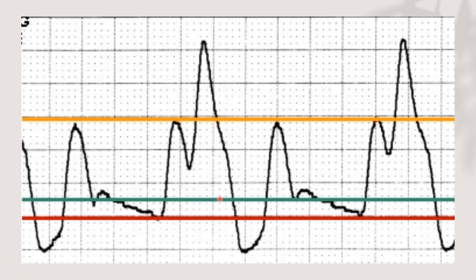Let's practice intra-aortic balloon pump interpretation. For inflation, we see a nice V but it is higher from the baseline, meaning early inflation. For the systole, the unassisted systole and assisted systole are at the same level — meaning early deflation. So this is a combination of early inflation and early deflation, and we can identify both together.